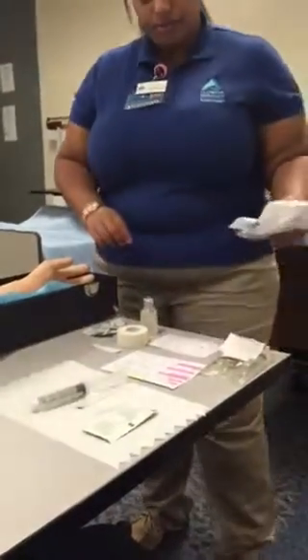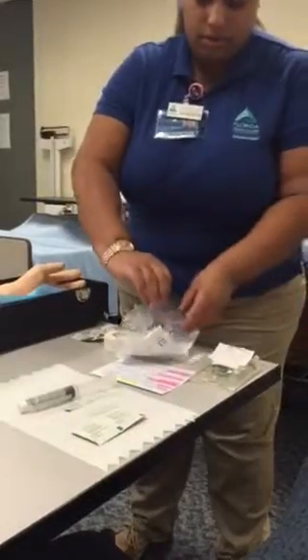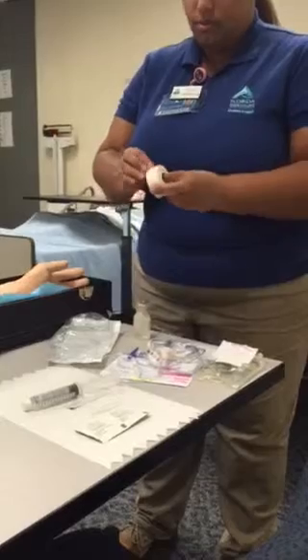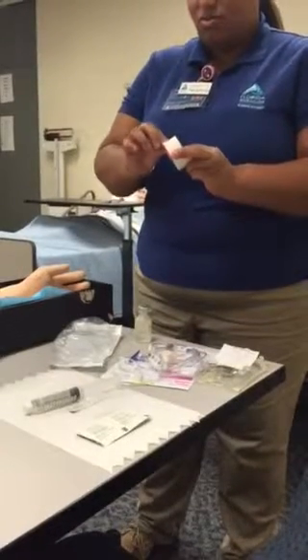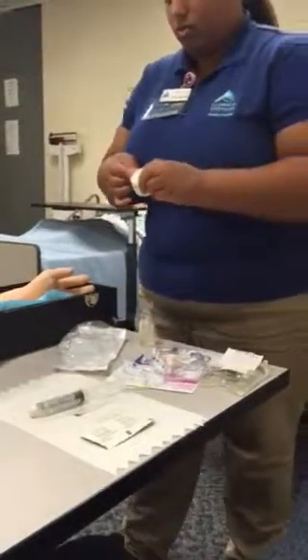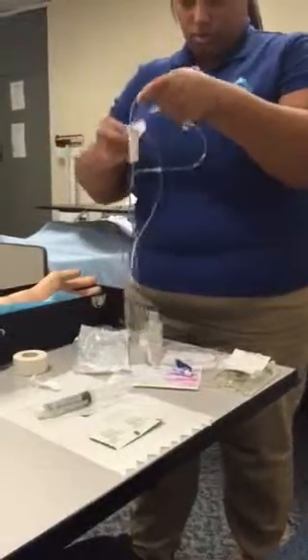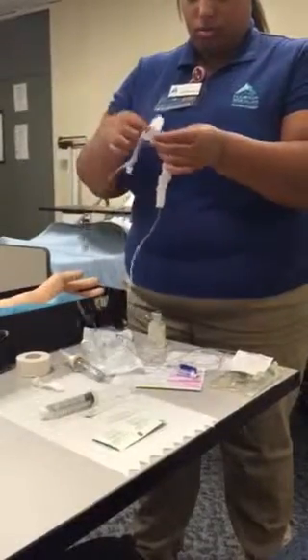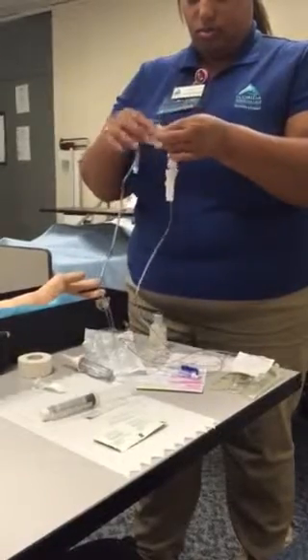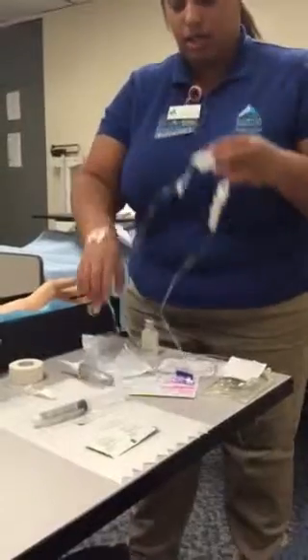Then I will need to open my bag. I'll go ahead and label my tubing with my name, my initials, and the date and the time that I set up this tubing.